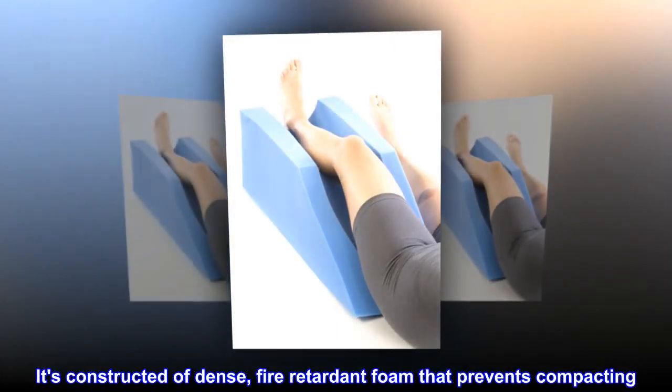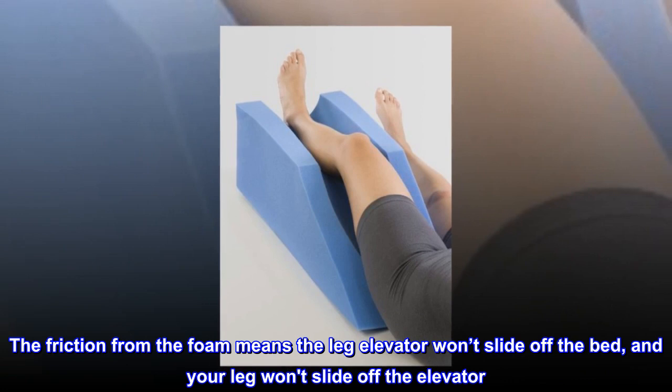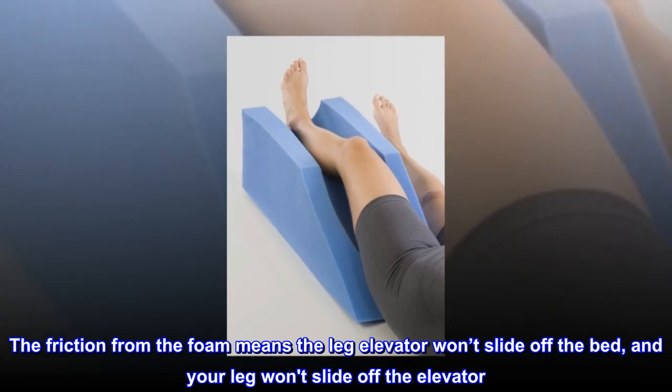It's constructed of dense, fire-retardant foam that prevents compacting. The friction from the foam means the leg elevator won't slide off the bed, and your leg won't slide off the elevator.